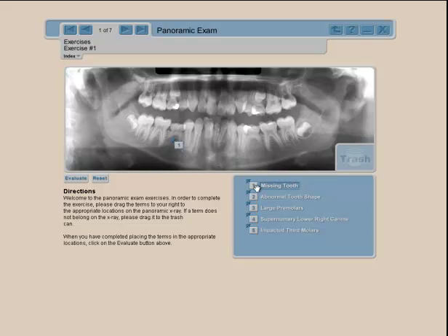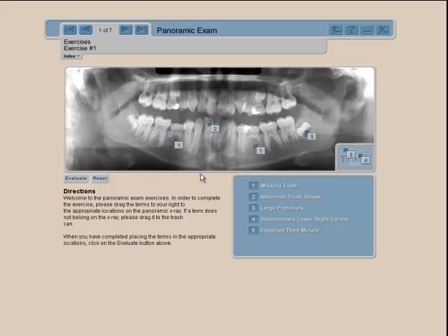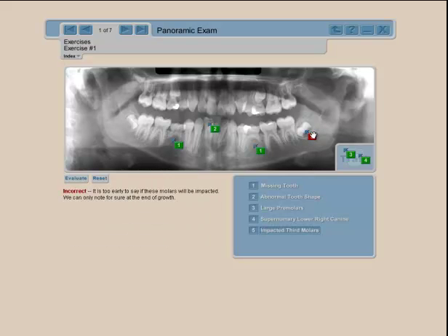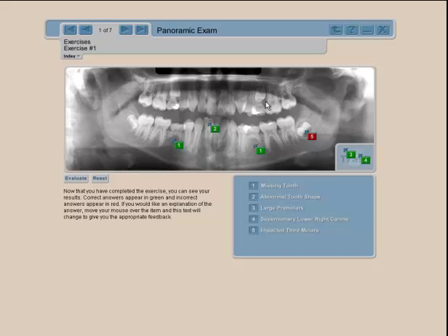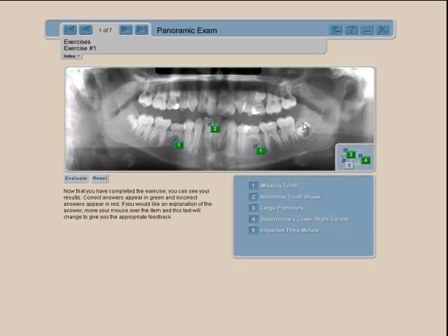In the exercises, you look at a panoramic exam — done before the digital era so image quality is lower, but they still work. You have a drag-and-drop tool to identify problems. I'll put number three in the trash, and place the impacted canine and impacted third molars. Evaluating myself, the feedback tells me it's too early because this patient is still in mixed dentition, so we have to wait before making a final decision.